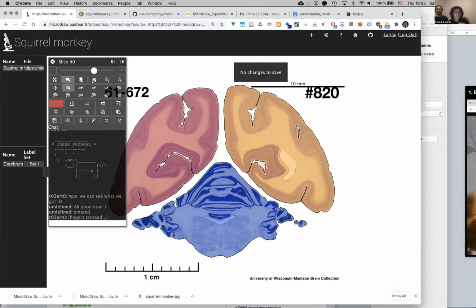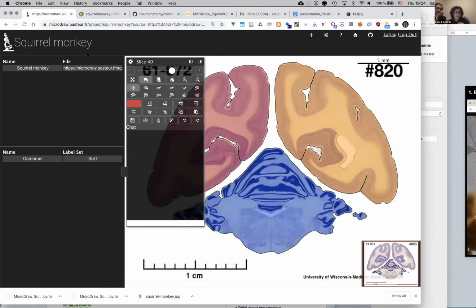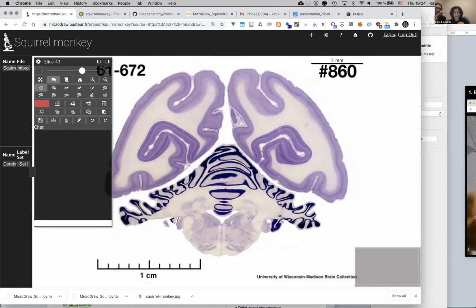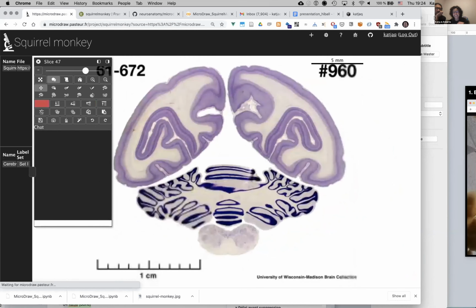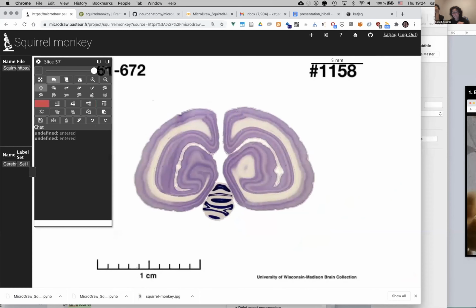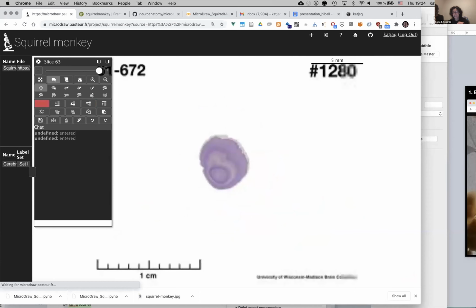And now I can maybe just quickly refresh. And I mean, you can do that all on your end as well, but now going through the slices, it's just such a pleasure to see how colorful and how densely colorful that is, isn't it? Because we all work together on the same data set, and that's so beautiful.